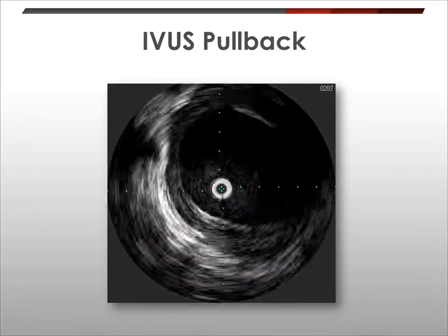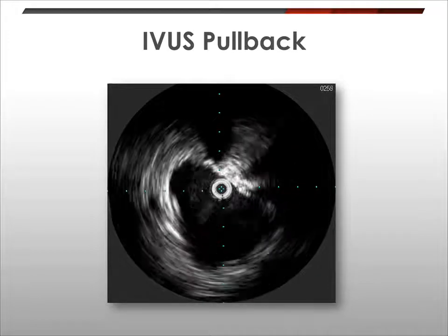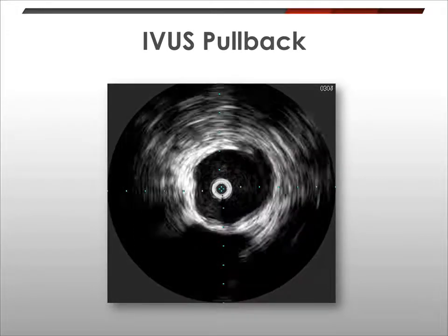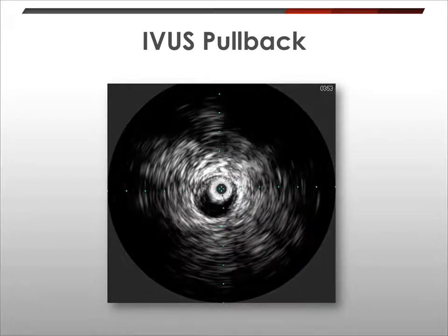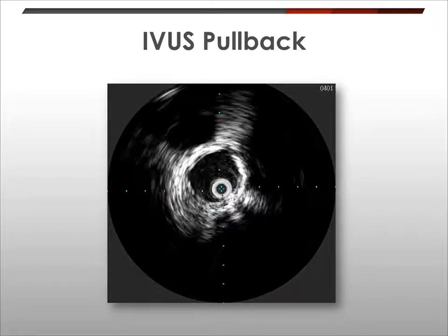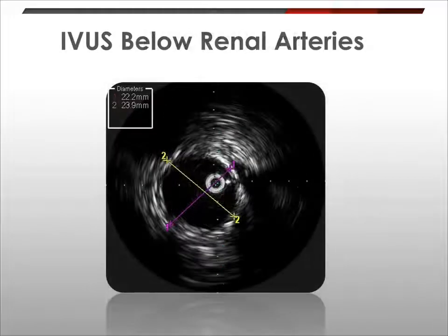diameter and the quality of the vessels, and then the aneurysm itself along with the amount of clot you may see there, and then the common iliac artery, both its diameter and the takeoff of the internal iliac artery, and then the diameter of the external iliac artery, so I can decide which side to put the main body up.